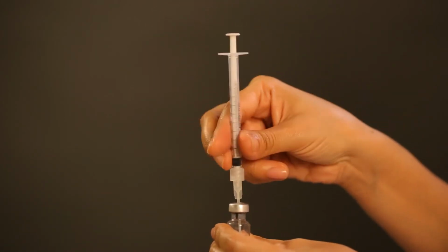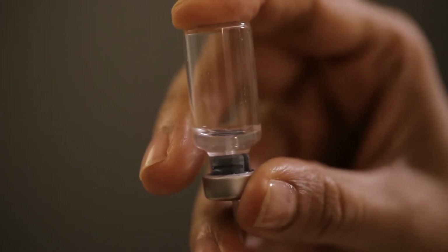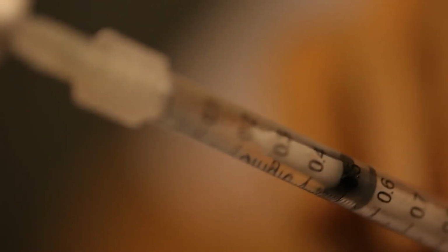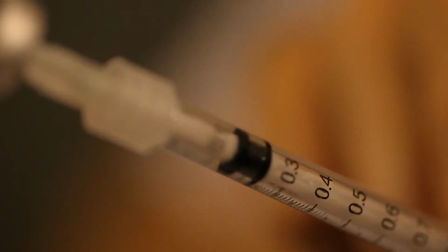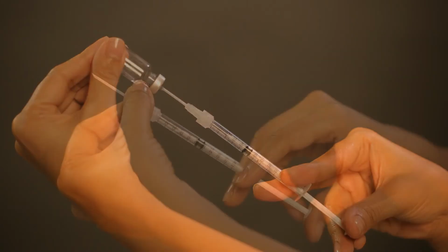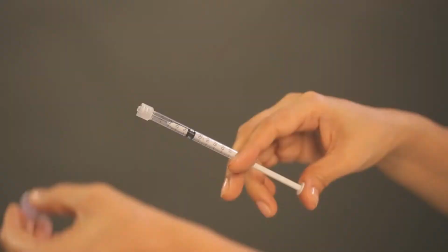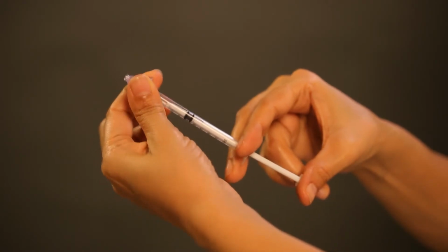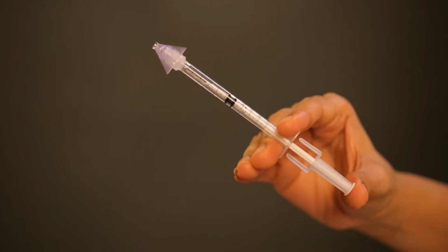Method of administration: reconnect the needle onto the syringe and readjust the needle depth. Withdraw 0.5 ml of the reconstituted vaccine into the syringe. If there is any air bubble in the beginning, push the vaccine back into the vial and then re-withdraw it. Once the entire vaccine is withdrawn, disconnect the needle from the syringe. Replace the needle with the intranasal spray device and ensure that the spray device is securely fitted. Fix the dose divider on the plunger of the syringe.